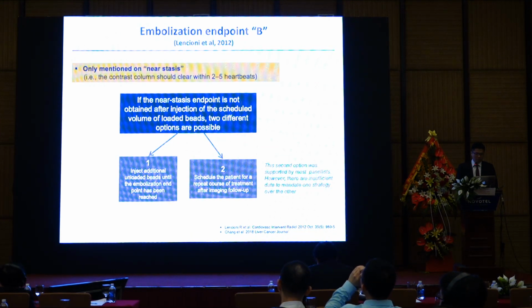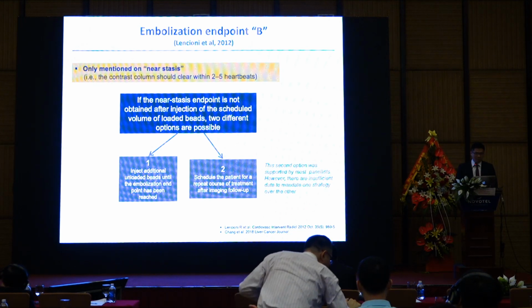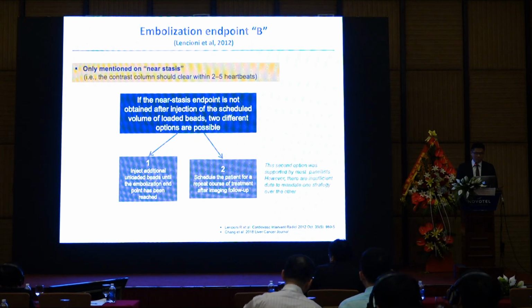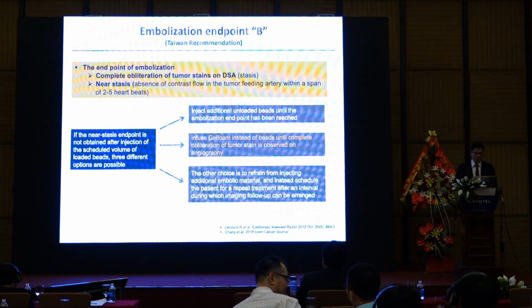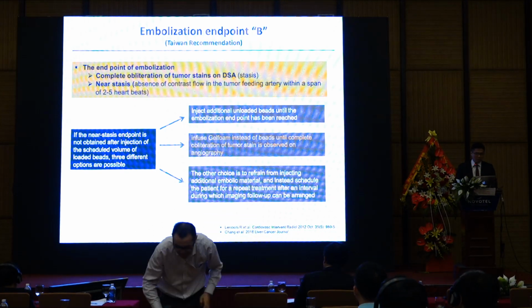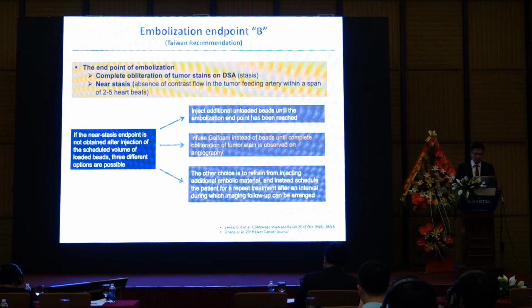So let's move to the endpoint. The endpoint in Lencioni's paper, they only mentioned near stasis, which means that the contrast column should clear within 2 to 5 heartbeats. But in our recommendation, we think that the first endpoint is the complete obliteration of the tumor stain under DSA. The second endpoint is near stasis, which means the absence of contrast flow in the tumor-feeding artery.